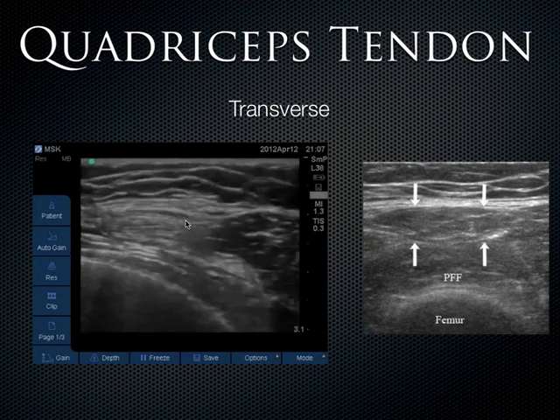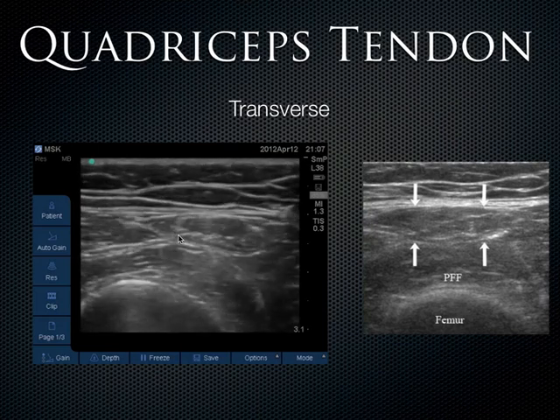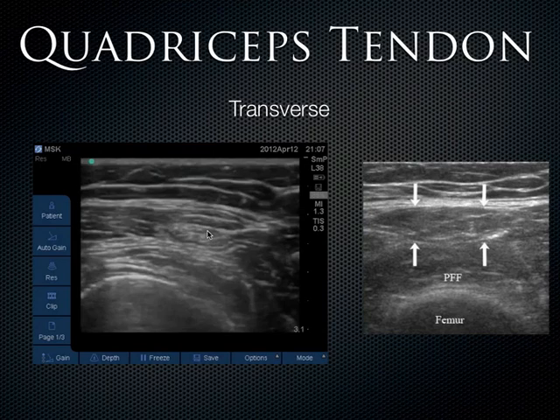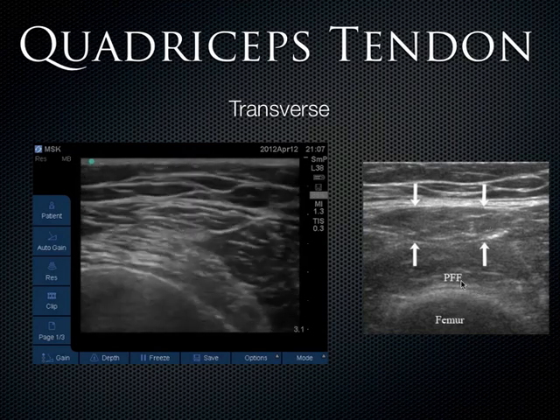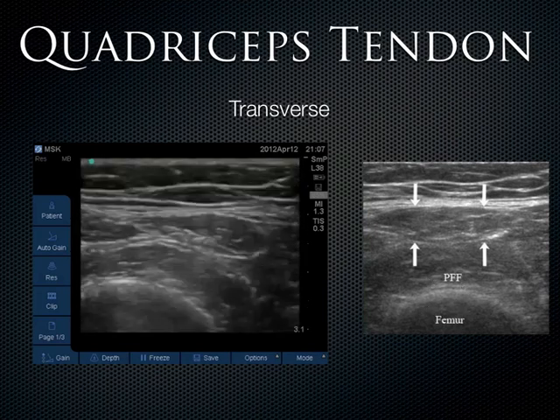So we eventually get into where the muscle is, and it stops being tendon. And then we come back down to where the tendon is. The tendon's got that fibrillar pattern to it. When it's in the short axis, it looks sort of punctate. The still image represents it here. And remember, there's always that prefemoral fat pad just above the femur there.